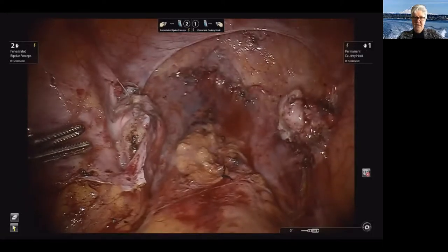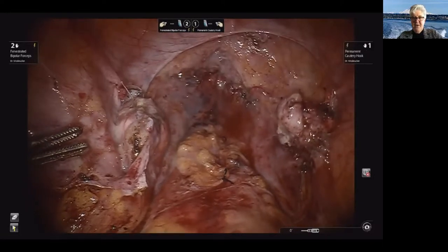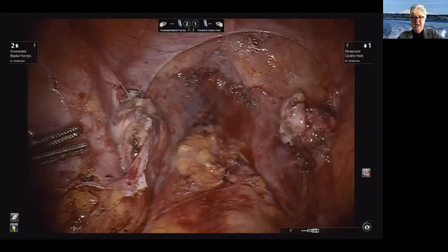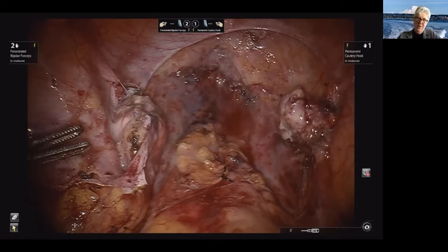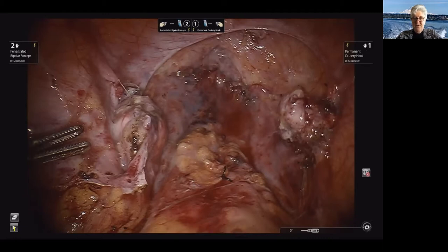Here's the afterwards picture. We did a hysterectomy on this patient and the white substance that you see is fibrin glue. We spray that when there's a large amount of raw surface in the pelvis, because it stops the small vessel oozing and helps to reduce the risk of adhesions.